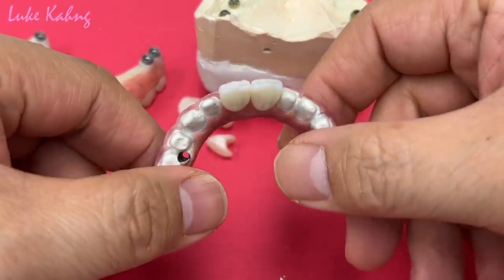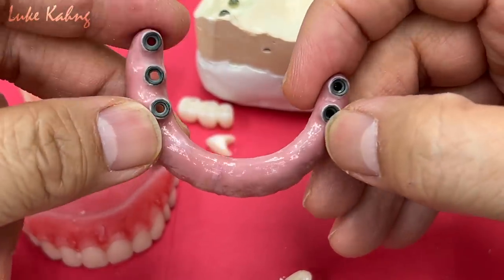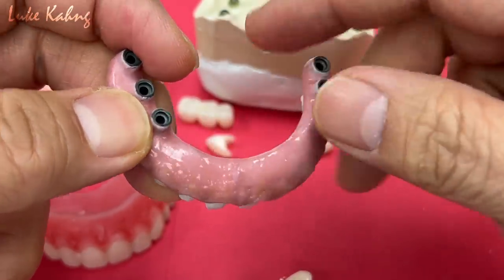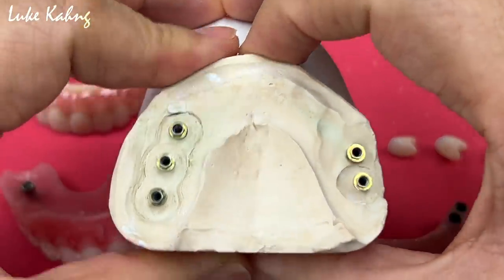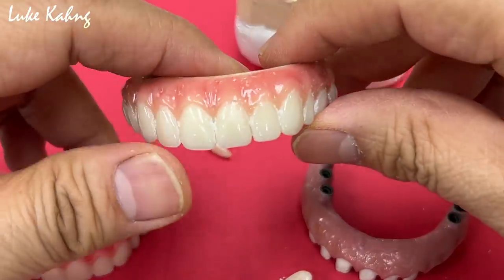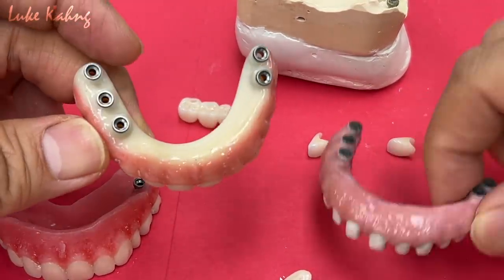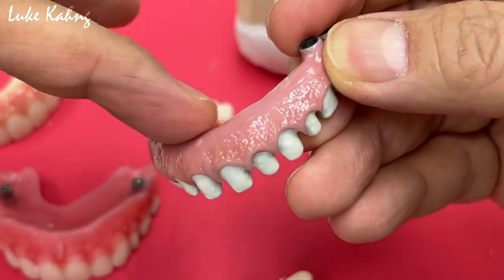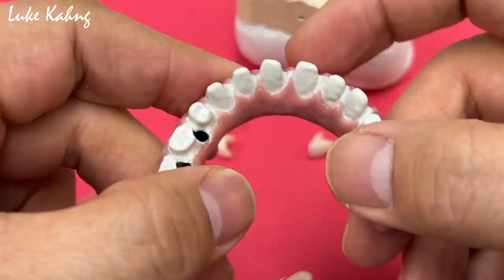It was a long journey, so we finished it with a long span. This is incredible. I know it's an old implant, cannot find it. Cannot place implants, so doctors and patients worry about their situations. So we made wax to set up the teeth and contour, just approve them, and then after that we made the PMMA bridges, and then we cut it more, even more in convexity, which is underneath the gum of patients, and then we made the ceramic. This is metal ceramic, 910 Celsius.